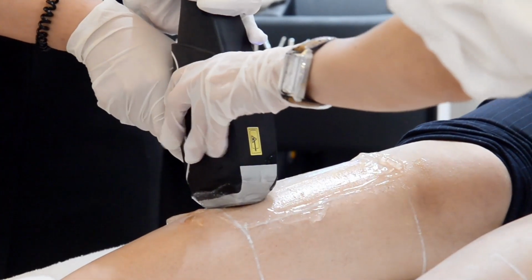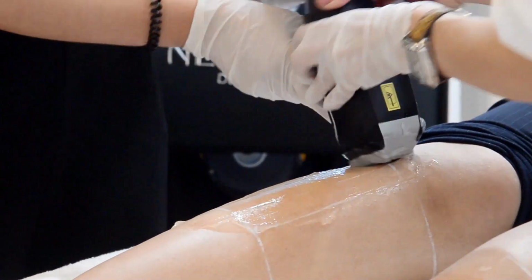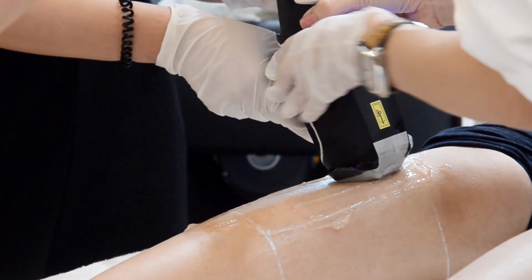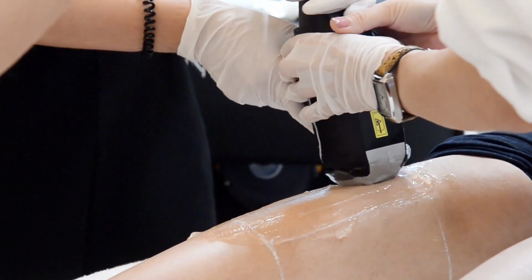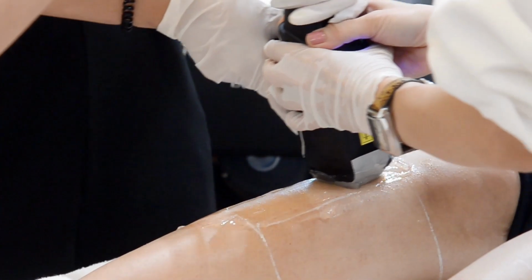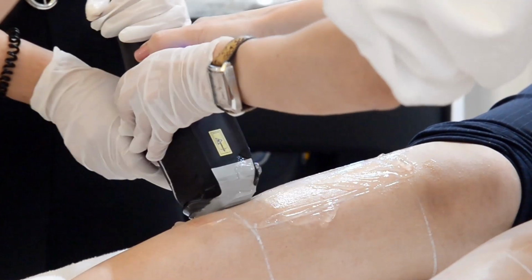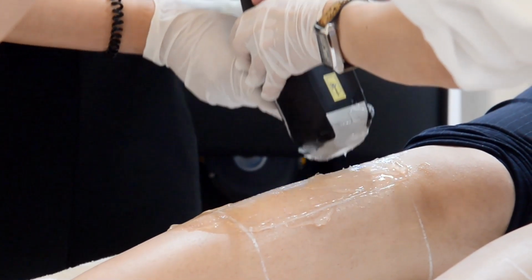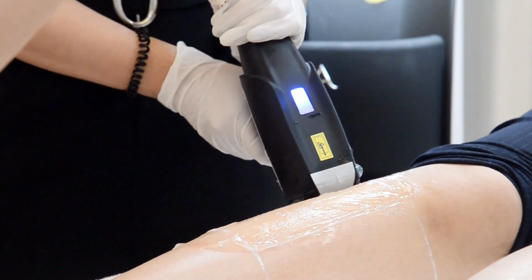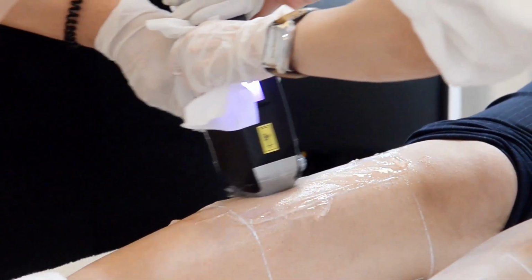Stop. Okay, so what's not correct is you are doing this. When you do this, the window of the device is not having full contact with the skin. So it has to be 90 degree perpendicular. You get what I mean? You cannot be gliding like this. It has to be 90 degree perpendicular to the skin. Okay? Let's try again. Not too slow. Have to be 90 degree.